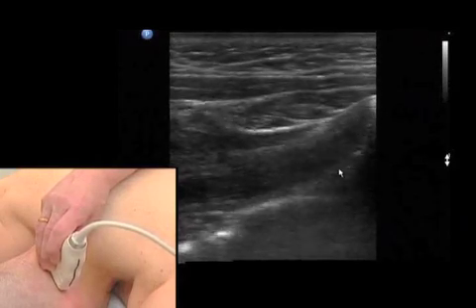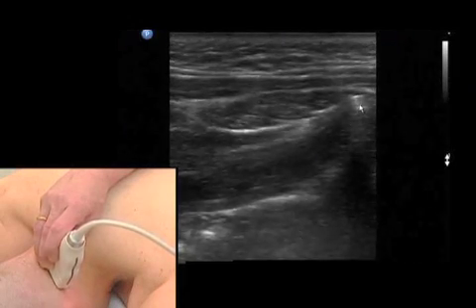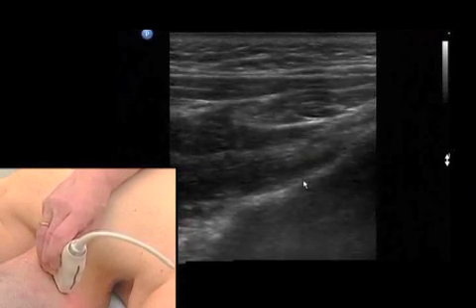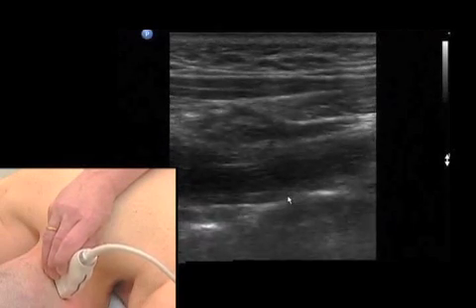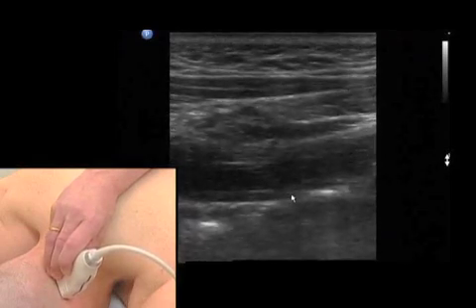What we have to keep in mind is, if we see the left and the right tubercle of the spinous process, we also see a white line, relatively steep. This is the lamina of the axis, and we have to keep that in mind just to be sure we are hitting bony landmarks.